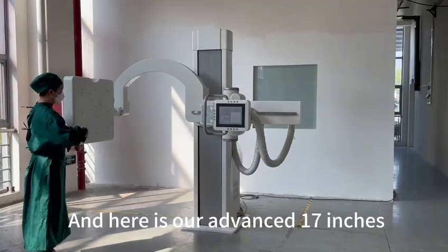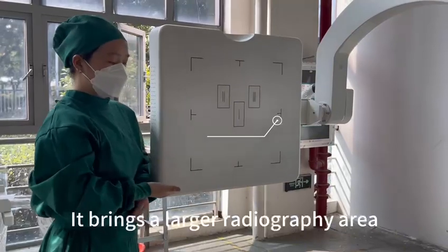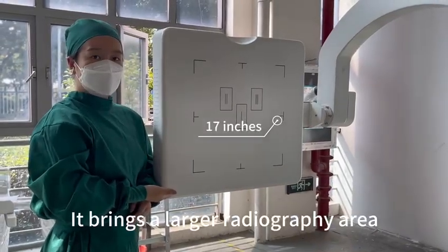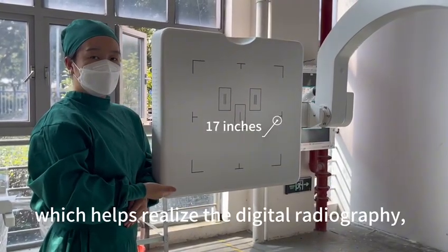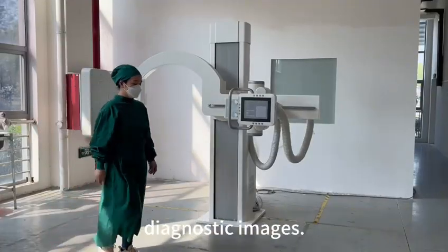Here is our advanced 17-inch flat panel detector. It brings a larger radiography area, which helps realize digital radiography and helps clinicians obtain high quality diagnostic images.